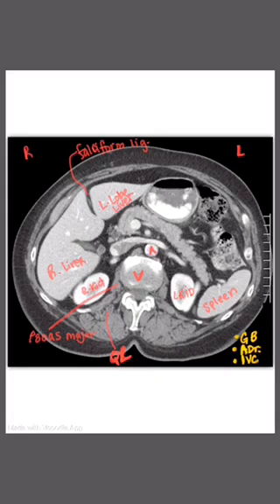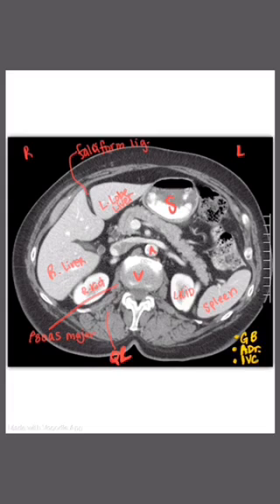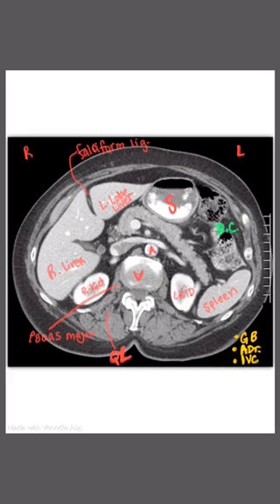And then this is the stomach — S for stomach. This over here on the left side is the descending colon — DC for descending colon.